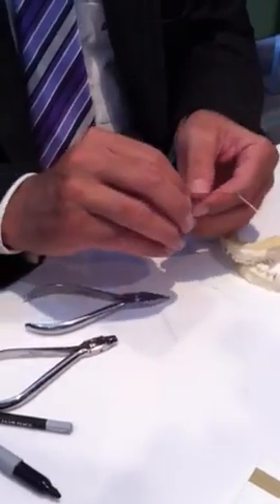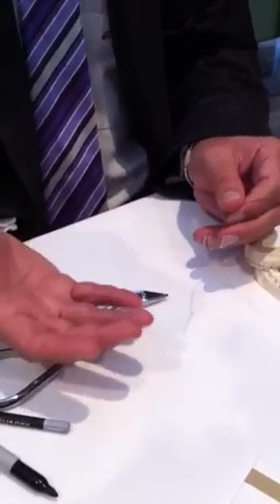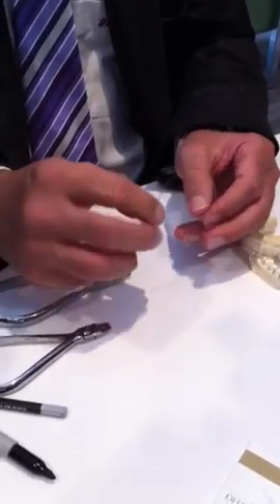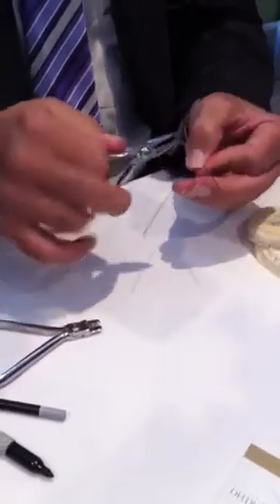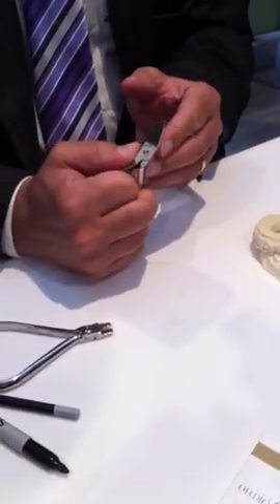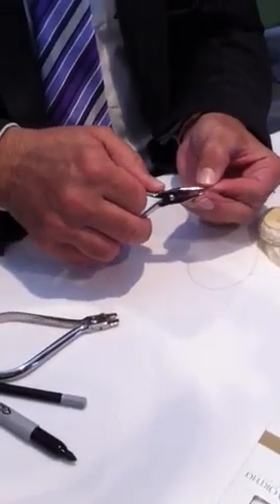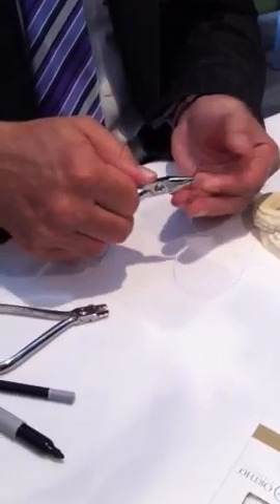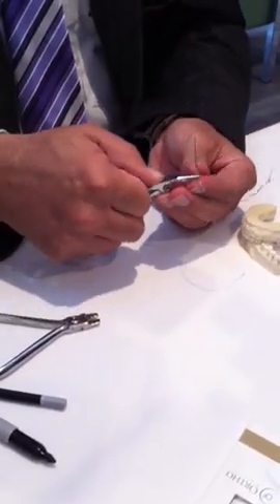So, very simple to bend — you can see that took just a matter of seconds. If you want to buy these preformed you can, but then of course you have to keep a large inventory. At every visit when the patient comes back in, I will check the amount of activation. If it needs more activation it's very simple: it's removed from the mouth and then again using the half-round end you can just open that angle. As you open the angle you get the activation. So if I just bend it on the other side just for completeness — remember the main thing is to find the mark, because if it's not then it's going to be asymmetric when it goes in the mouth.